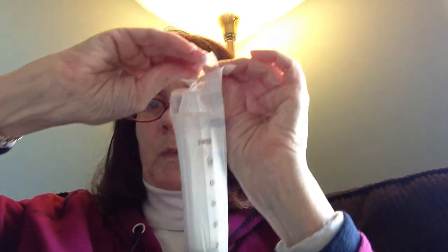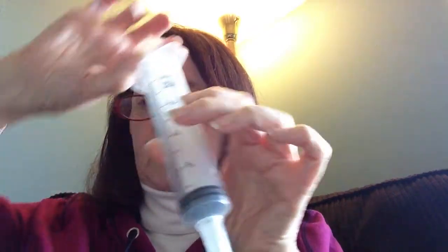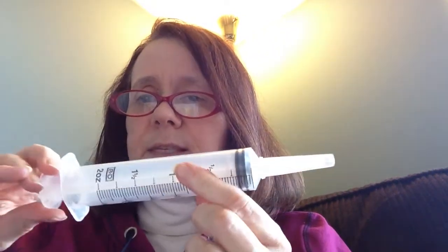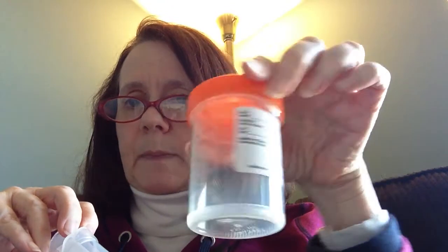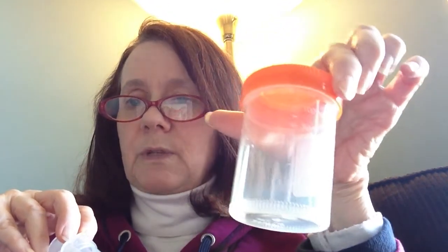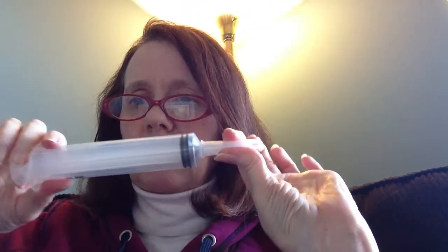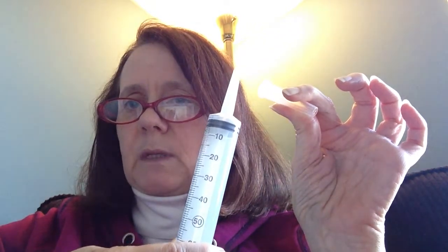I'm going to peel this open for you and then show it to you up close and personal. So this is your 60 milliliter syringe that I write about frequently, basically 2 ounces in American measurements. And this is what you'll use when you finish mixing your cocktail in your sterile specimen cup that you need to have. If you're going to do installations at home, you will purchase sterile specimen cups, and you will mix the cocktail in here, and then once the cocktail is ready, you will remove the cap off the 60 milliliter syringe, or if you have a 40 milliliter, whatever the size is. Most of us tend to use 60 milliliter.